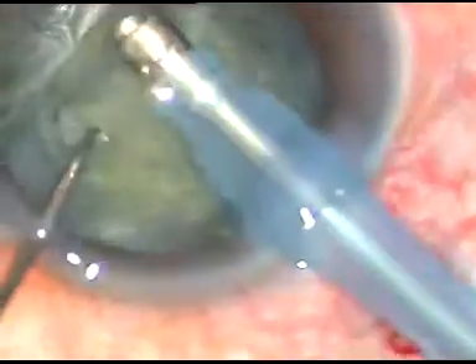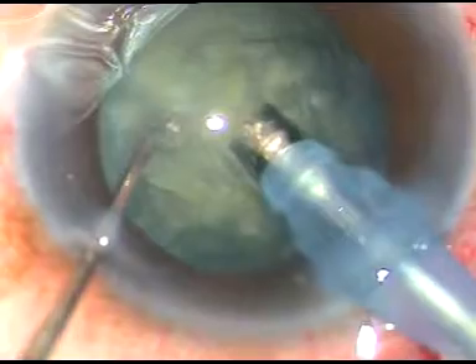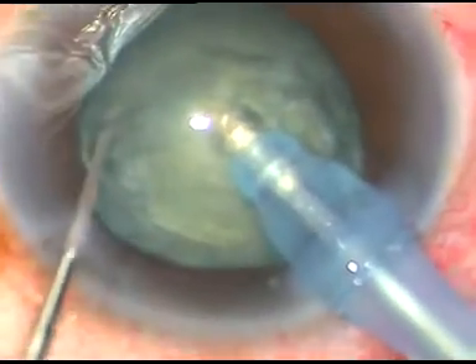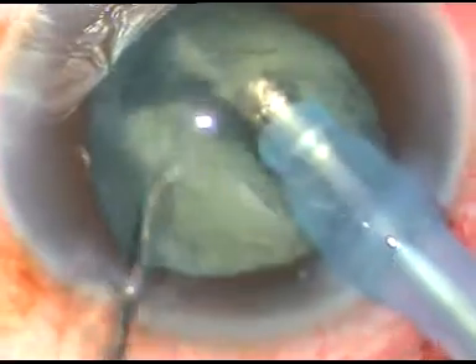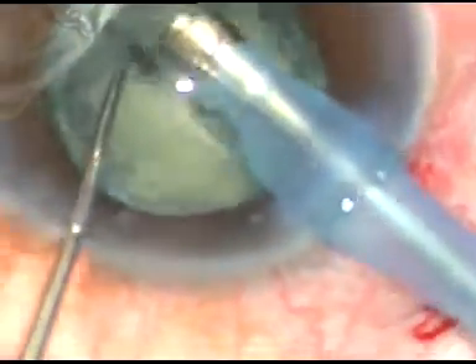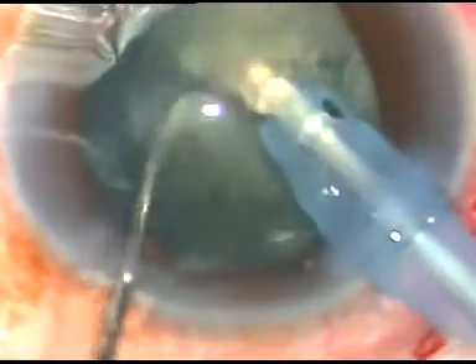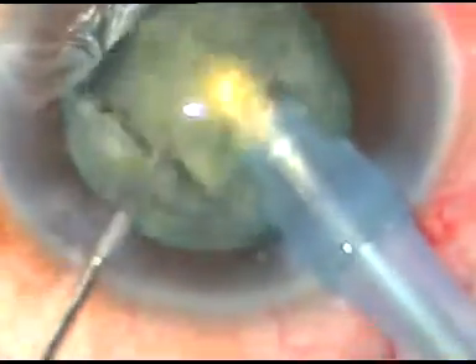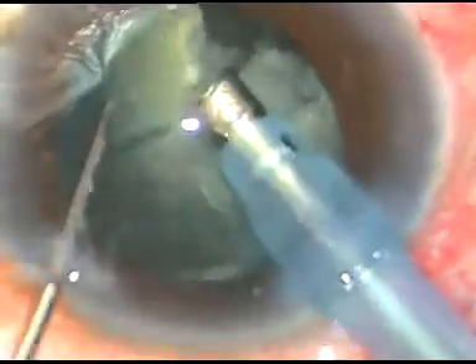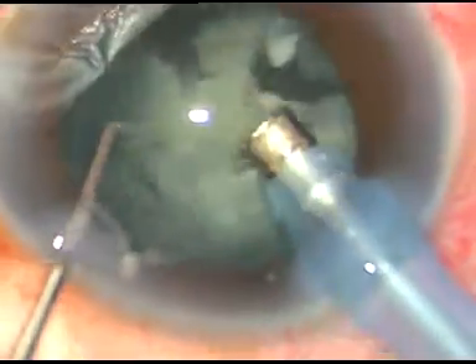This is a small chopper which has been designed by me — it's just a modified Szynski hook. I impale the tip deep into the nucleus and make the first chop. The cataract is soft, we can say it's like grade 3, and we can easily chop the nucleus in such cataracts.